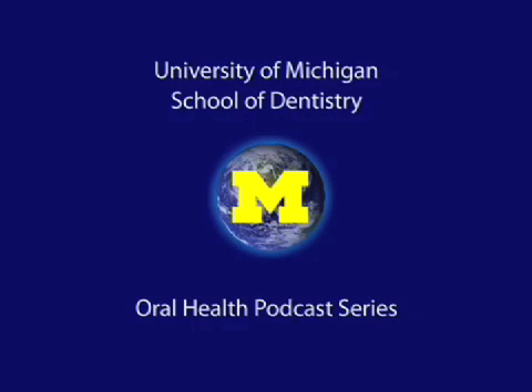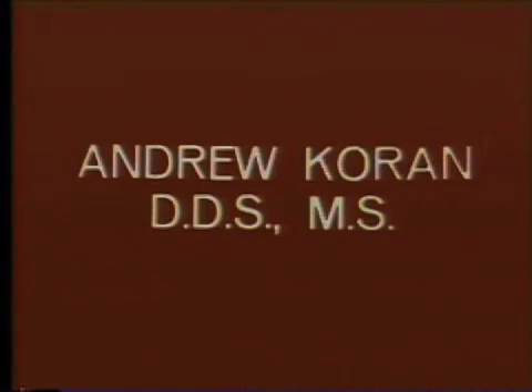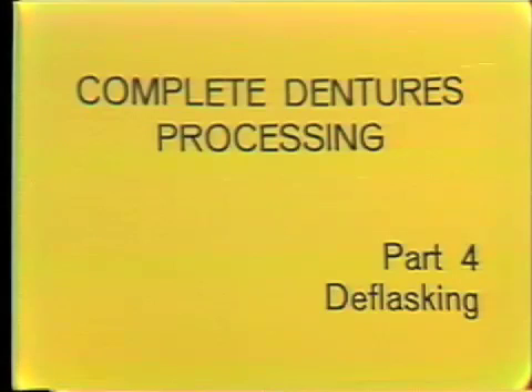Welcome to the University of Michigan Dentistry Podcast Series, promoting oral health care worldwide. We have now completed the processing of the maxillary and mandibular denture by curing the flasks in 165 degree Fahrenheit water for 12 hours, and we are now ready to deflask the dentures.